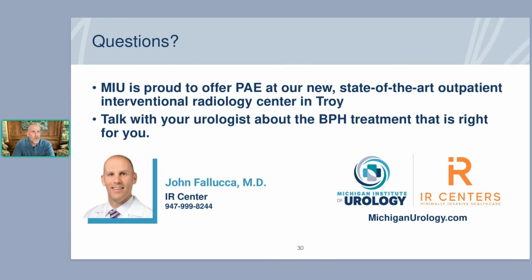So there is another question asking about having a PAE 2 years ago. It was good for a while, but still getting up 4 times at night. Can you have the procedure again? And the answer to that question is yes, we can perform the procedure again. You know, it all depends on since you've had a PAE previously, I would want you to see the urologist, and we would likely do a similar workup again just to make sure that you continue to be a good candidate for the PAE.